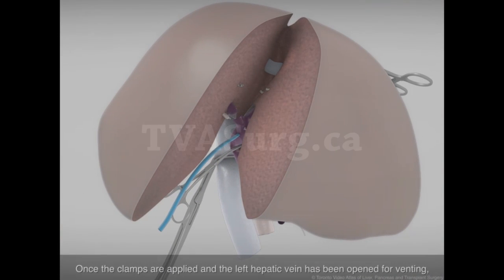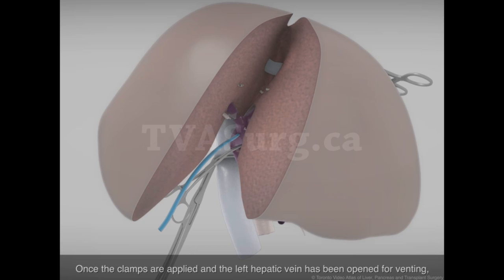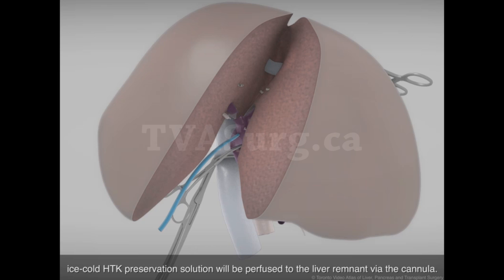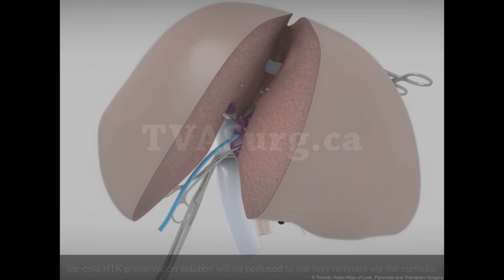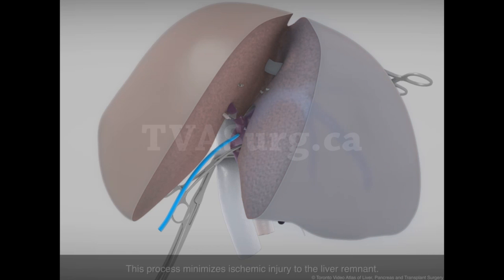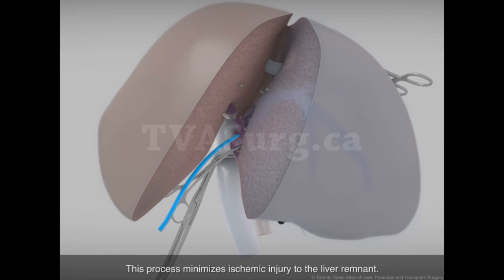Once the clamps are applied and the left hepatic vein has been opened for venting, ice-cold HTK preservation solution will be perfused to the liver remnant via the cannula. This process minimizes ischemic injury to the liver remnant.